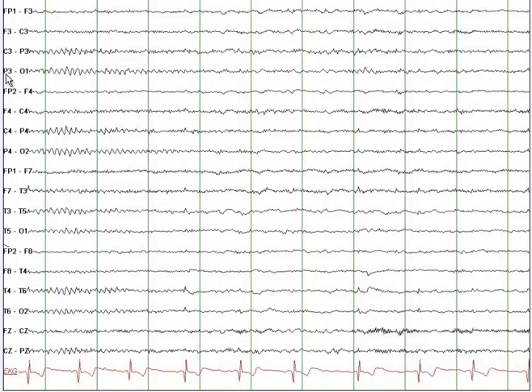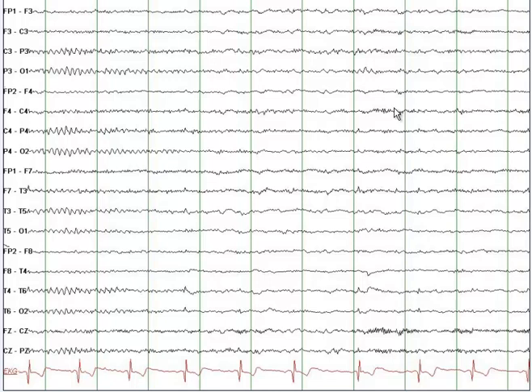The parietal occipital electrodes are placed on the back of the head, so these are posterior electrodes. You see a posterior dominant alpha rhythm of 9 Hz in the parietal occipital region — on both the left side (P3O1) and the right side (P4O2). Without any eye opening or eye blink artifact, this person loses the alpha rhythm. The defining feature of stage 1 sleep is a drop in alpha in more than 50% of the epoch, so half of this page does not have that alpha rhythm, qualifying it as stage 1 sleep.